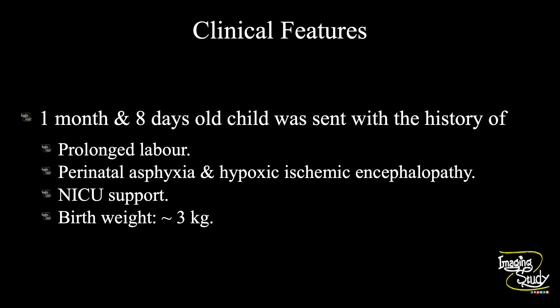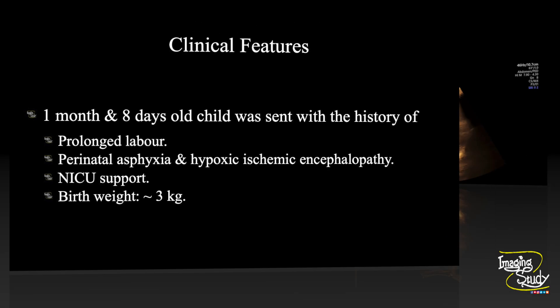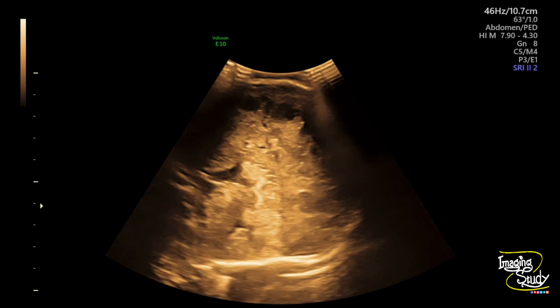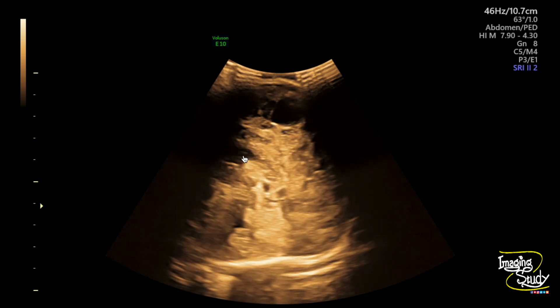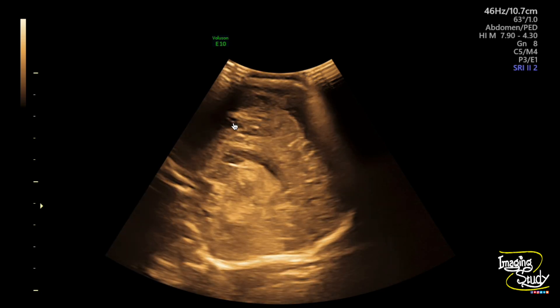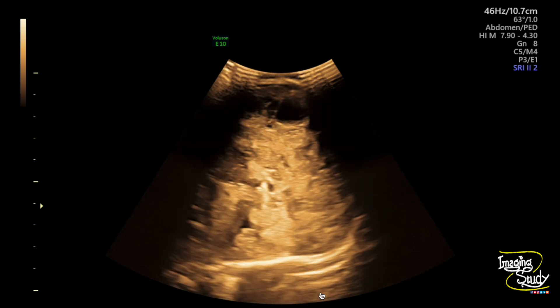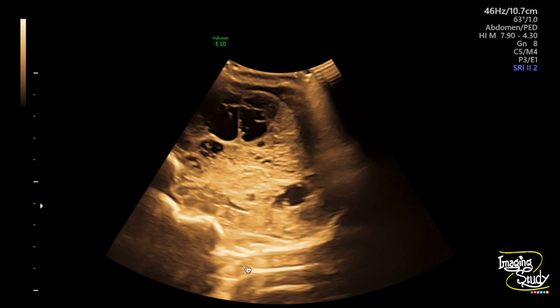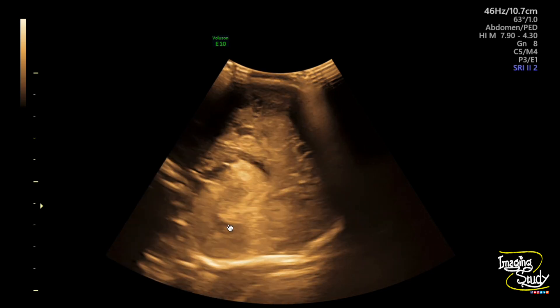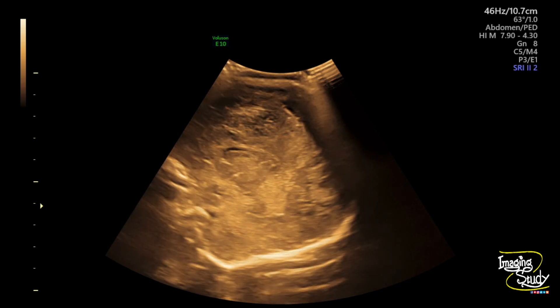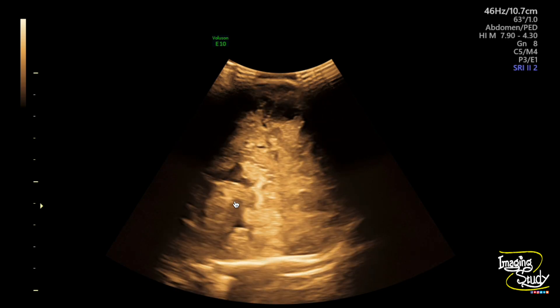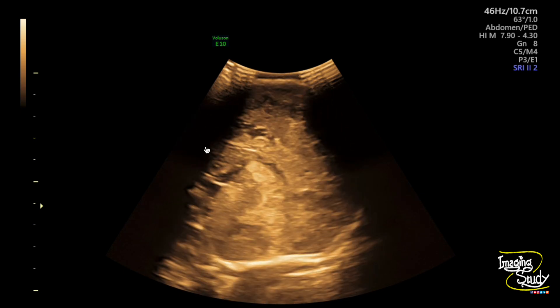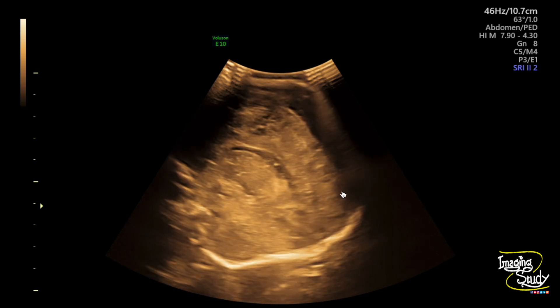Let's see what we have got on ultrasound. Here you can see the sagittal section of the brain through the anterior fontanelle. You can see the lateral ventricles here, and diffused cystic spaces throughout the cerebrum. The cerebellum looks apparently normal, and there is the 4th ventricle and the 3rd ventricle. But throughout the brain parenchyma you can see diffused cystic spaces involving the frontotemporal, parietal, and occipital lobes.